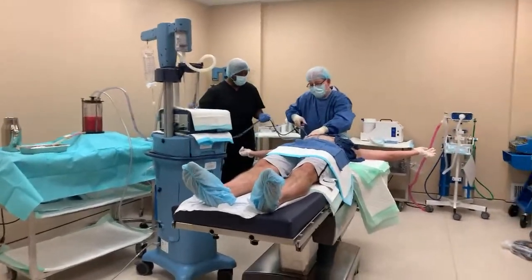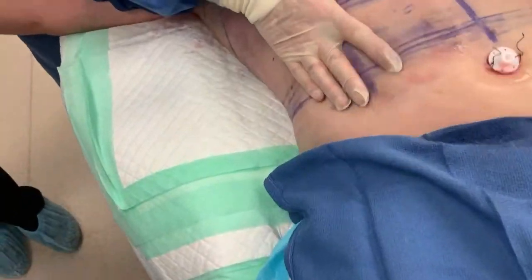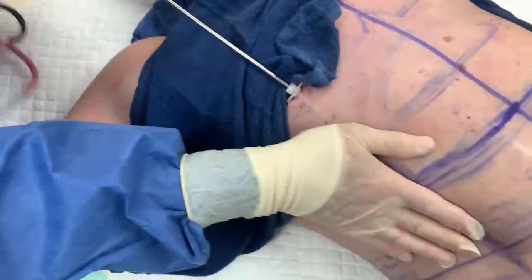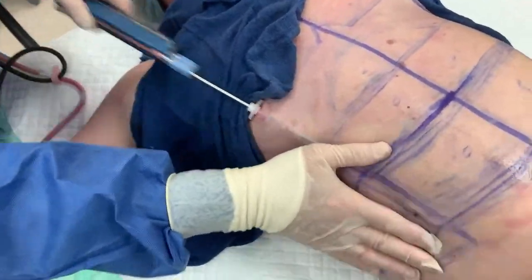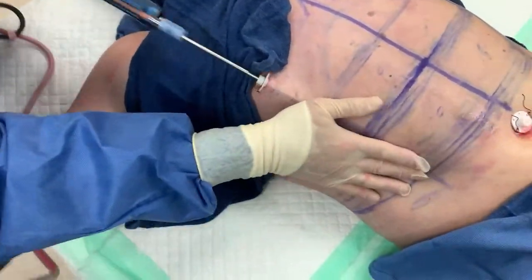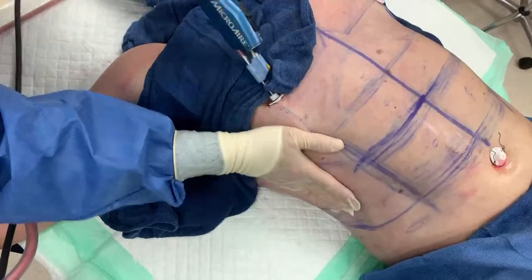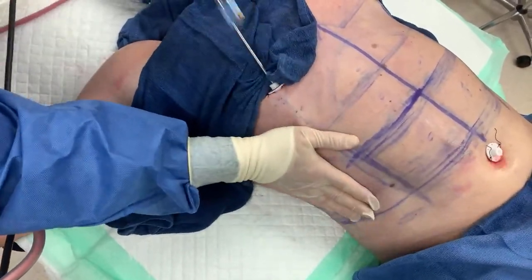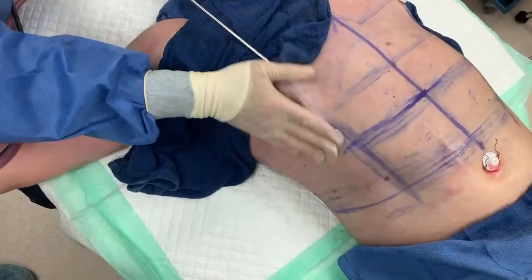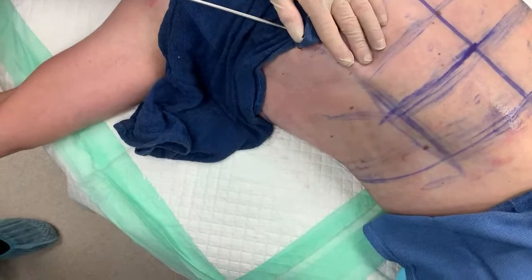It's laying here, it's looking pretty. So here we are in the belly — getting the semi-lunaris, getting it with guides. It's all about lines and then shadows, so creating this line going down low. I created that line, and then the shadow, getting down to the hip. He's behaving himself — he's being a good patient, so he's allowing me to work. If people allow me to work, I can do more.